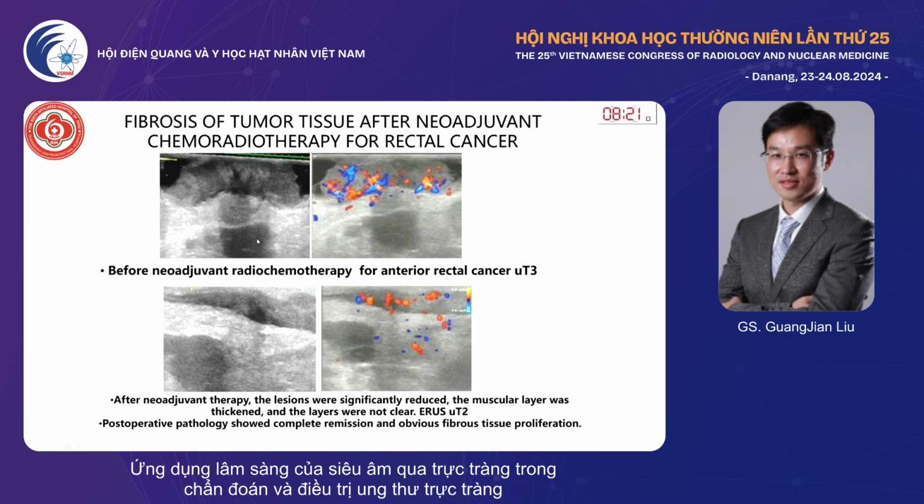And also for this one, we can see it's a T3 tumor, and after treatment, the wall is still thickened and the layer is not clear, so it's very difficult to judge. But after resection, the tumor showed a pathologically complete response.